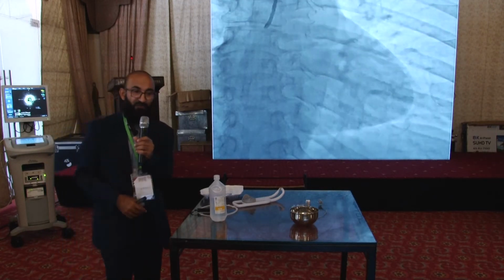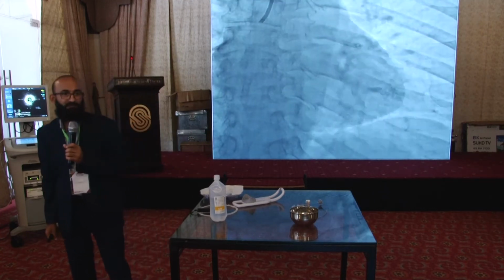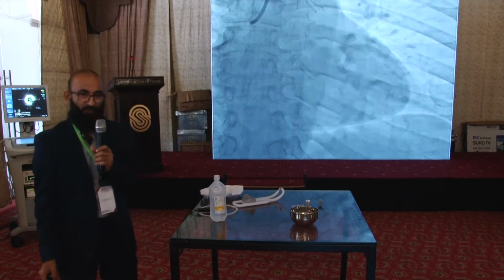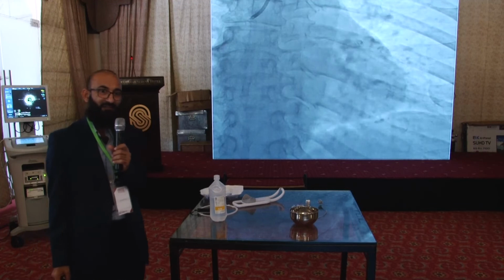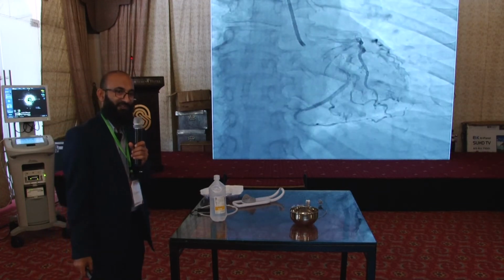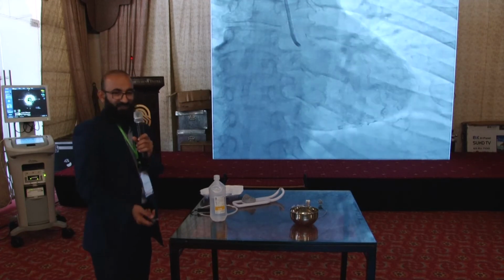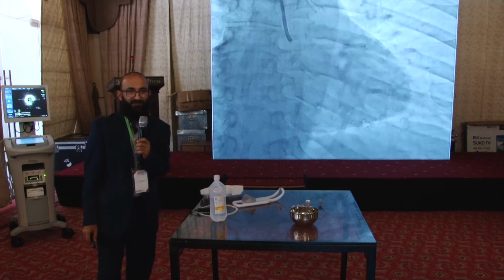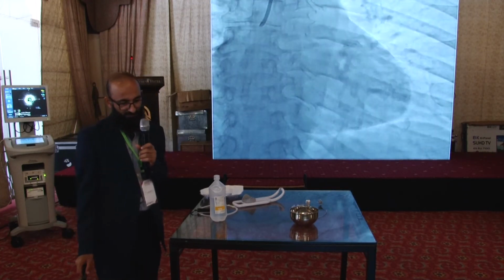And look here, if you see it. So what do you think about this ostial left main? What is your take on this? Anyone who wants to say a couple of words about it? So this is the left main. Yeah, perfect. So what are you going to do next with this patient? Perfect. Can we go to the next?